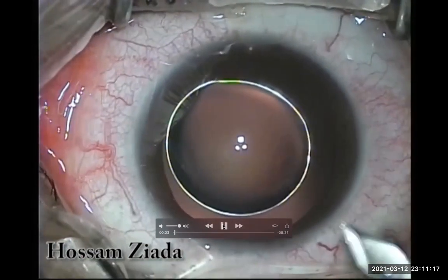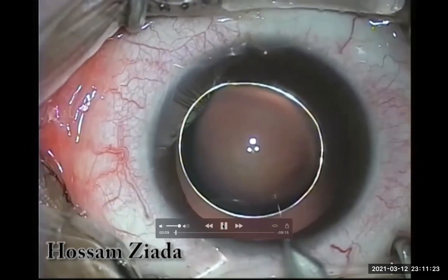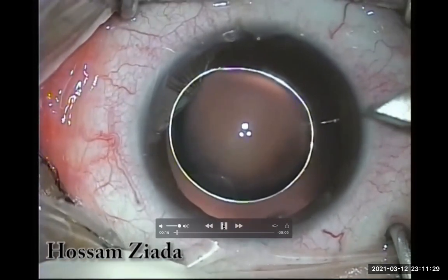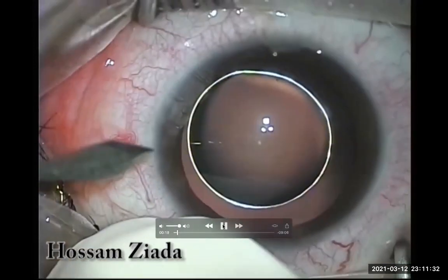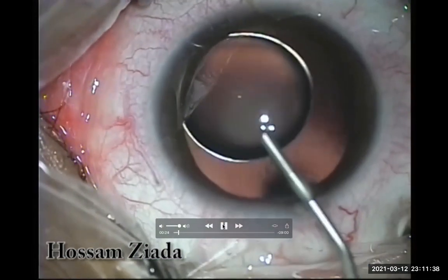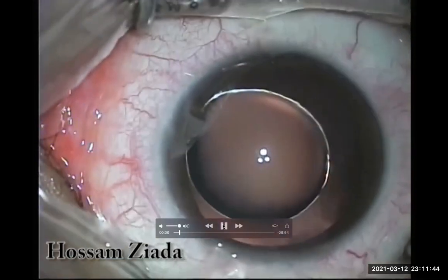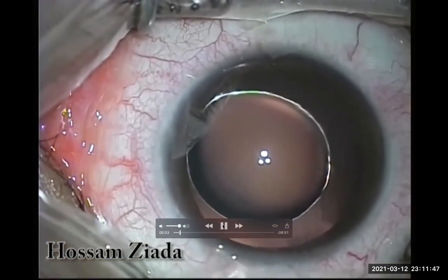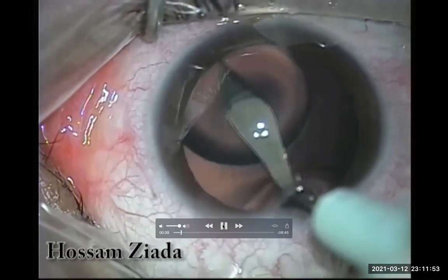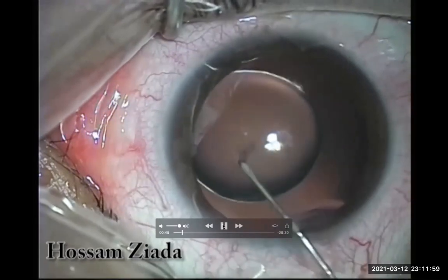As you can see, the pupil is dilated and the lens is in its place because the patient is lying on her back on the operative chair. I'm going to extract this lens which appeared like a sun at the sunset behind the horizon. I tried to keep the lens in the lens bag, but it was impossible, so I'm going to open the capsule to avoid excessive manipulation, as the zonules were almost entirely absent.